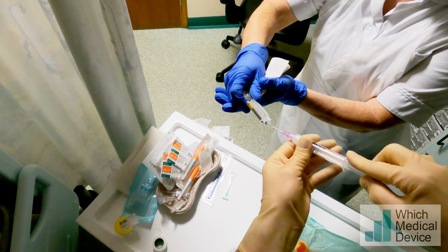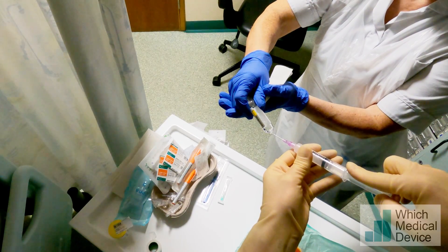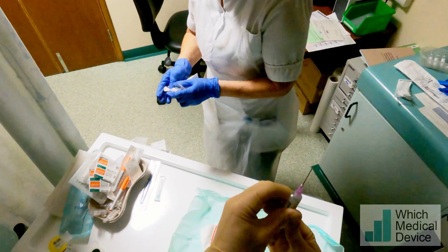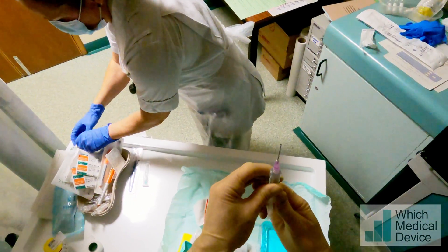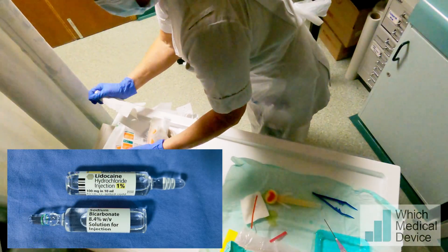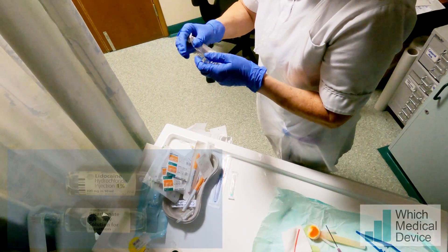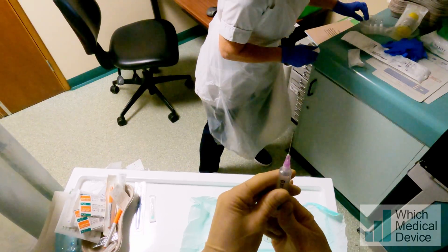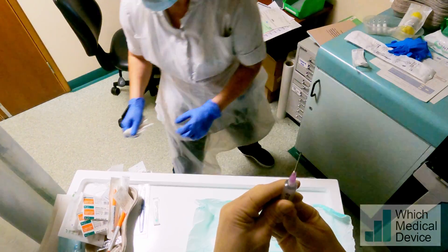So I'm taking 9 millilitres of my lidocaine 1% and I'm going to mix it with 1 millilitre of 8.4% sodium bicarbonate which will neutralise the acidity and make it much less uncomfortable to inject. This works with lidocaine, it works with xylocaine and adrenaline, but if you mix it with bupivacaine it will precipitate.